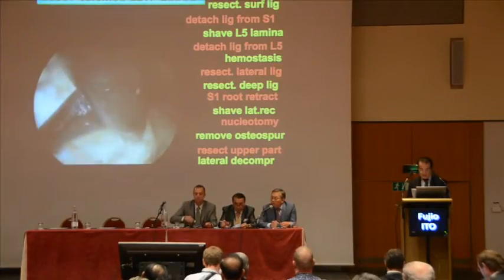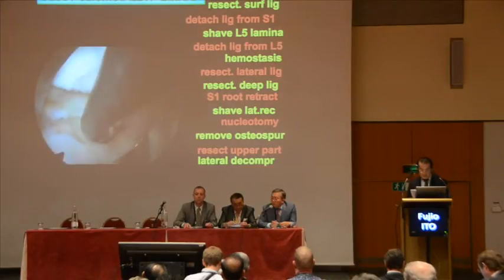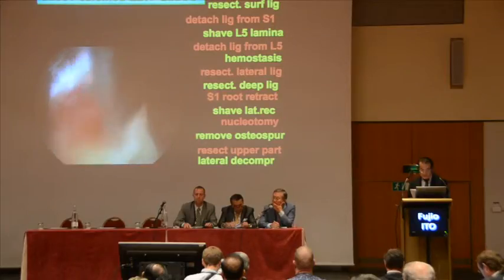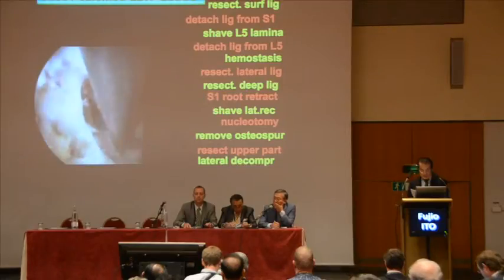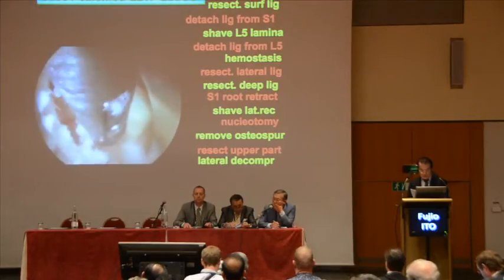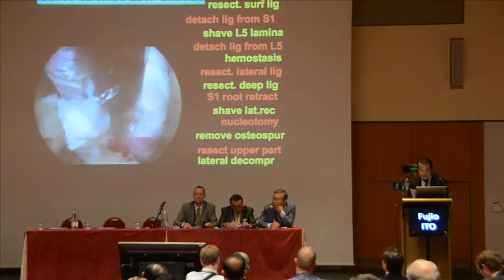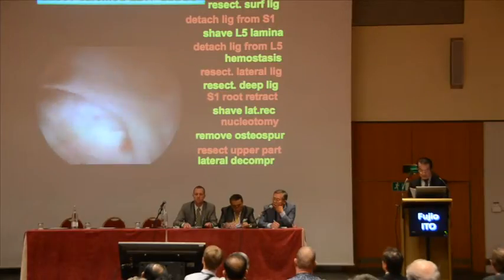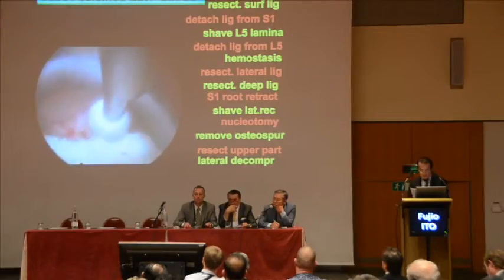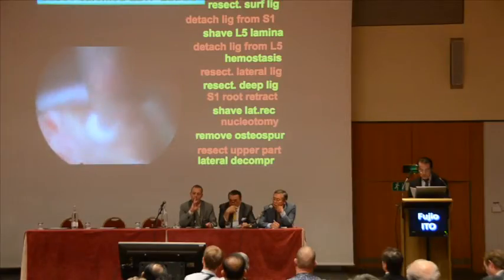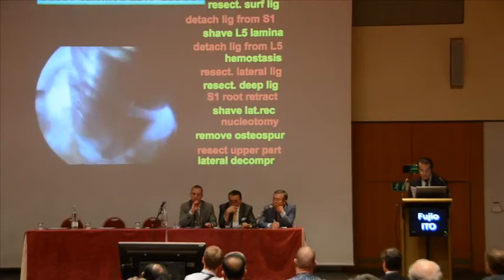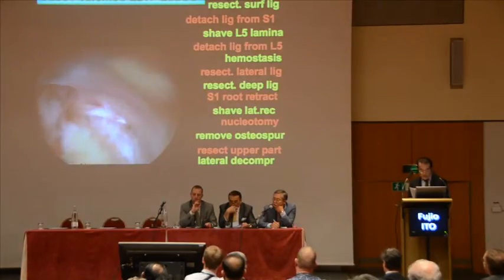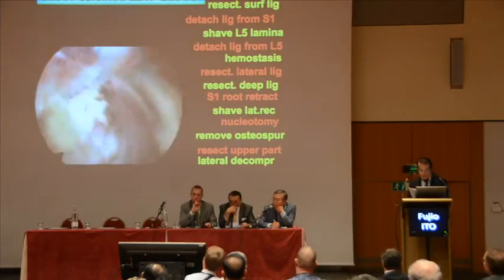Case 1 is calcified LDH and lateral recess stenosis. First, drill the S1 lamina. Next, resect the yellow ligament surface layer using a punch. Then detach the S1 laminar ligament using a curette. Conversely, shave the upper L5 lamina and detach the ligament. Bleeding must be stopped using a radiofrequency electrode. The yellow ligament along the lateral recess must be resected using a curette. Then detach the yellow ligament deep layer using punch forceps. The oblique cannula is suitable for retracting the S1 root. The lateral recess osteophyte must be shaved using a diamond burr. From the S1 root space, you can remove the protruded nucleus using forceps, while the osteophyte must be removed using a diamond burr. If required, the upper portion may need to be decompressed. As a result, the spinal root should be completely decompressed at the lateral portion.